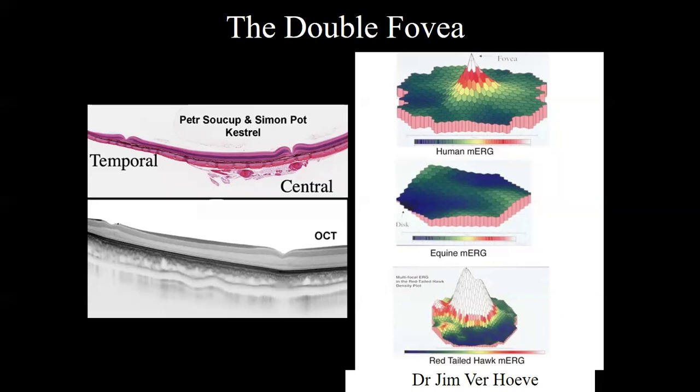Okay, visual acuity. The portion of the retina that is most useful for visual acuity, in other words, it has the most ganglion cells and the highest number of cone photoreceptors, is going to be the fovea. And the fovea is defined by this V-shaped indentation. And then I already mentioned these are the shadow of the ganglion cells, and then the black here is the shadow of the nerve fiber layer. So the nerve fiber layer disappears over the fovea because it emanates from the fovea. It doesn't cover the fovea.